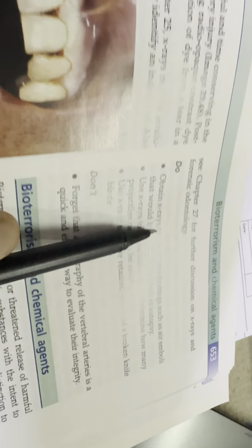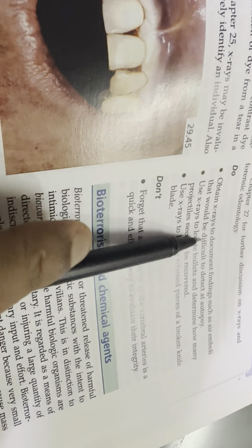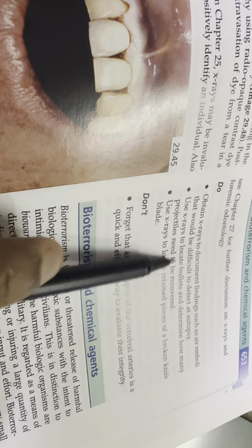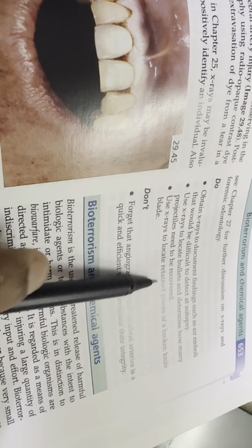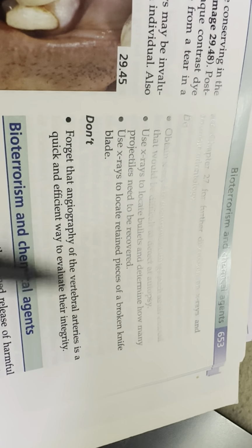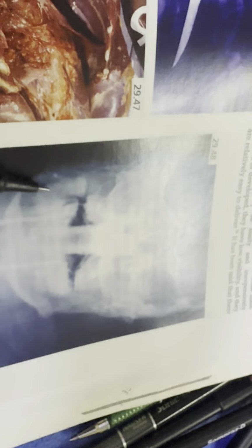Obtain X-rays to document findings such as air emboli that would be difficult to detect at autopsy. Use X-rays to locate bullets and determine how many projectiles need to be recovered. Use X-rays to locate retained pieces of a broken knife blade. Don't forget that angiography of the vertebral artery is a quick and efficient way to evaluate their integrity. Thank you.